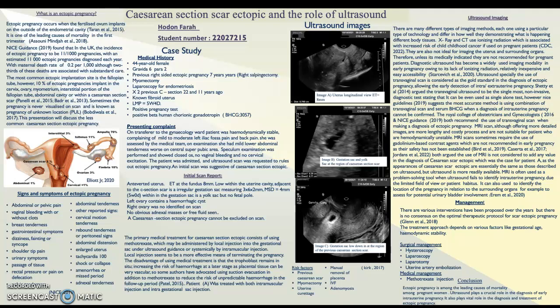According to the Royal College of Obstetricians and Gynaecologists 2015, 3D ultrasound takes longer to perform, therefore is associated with higher power output than that of 2D, which is not in accordance with the ALARA principle. Furthermore, Looney et al. 2021 states the use of 3D in early pregnancy is not recommended as a standalone clinical tool and does not replace 2D ultrasound.